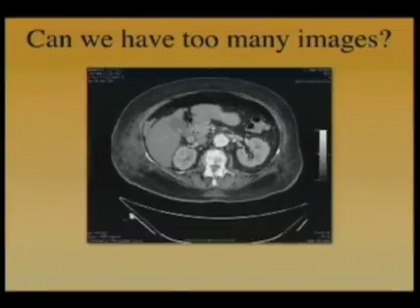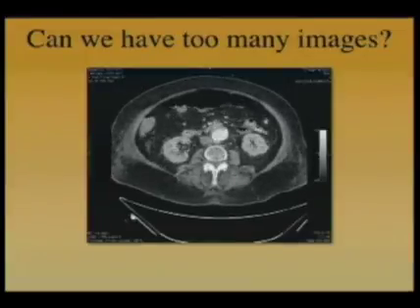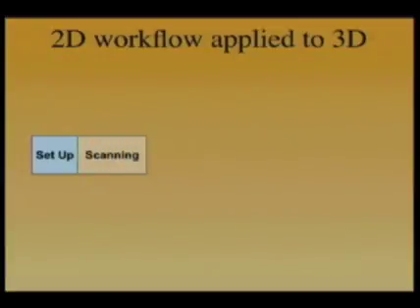Certainly reviewing all these images can be very, very time consuming. And if we produce too many planar images from ultrasound, we'll be in the same situation. If you simply apply a 2D workflow to 3D, here is what you get. You begin with the same setup. You spend some time scanning.